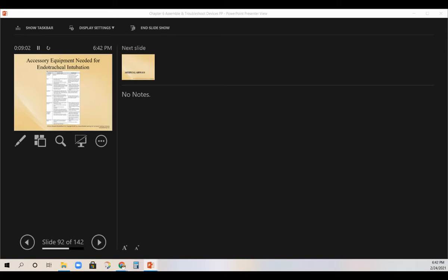The capnograph monitor provides a numerical PETCO2 display and a waveform, and confirms placement. If you get condensation or secretions in it, it will affect the accuracy, and you should consider a different confirmation device if the secretions are excessive. Ensure the sensor is placed on the ET tube, as placing it further away can affect the accuracy.